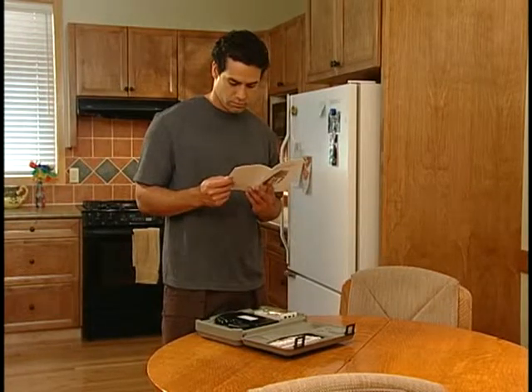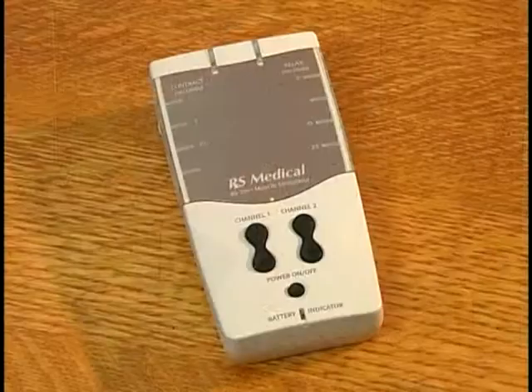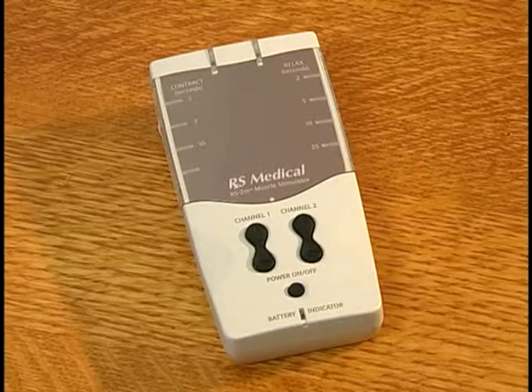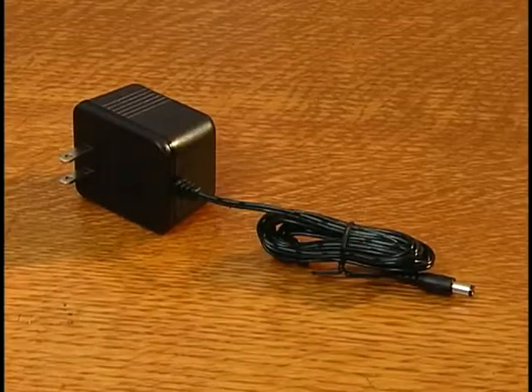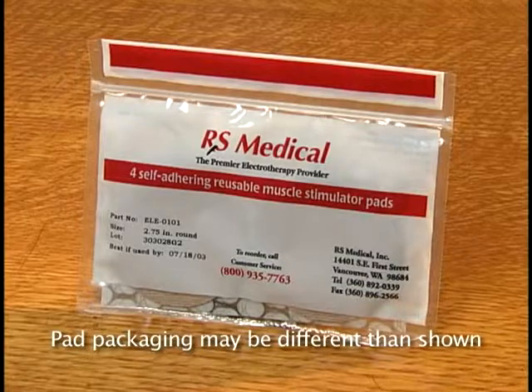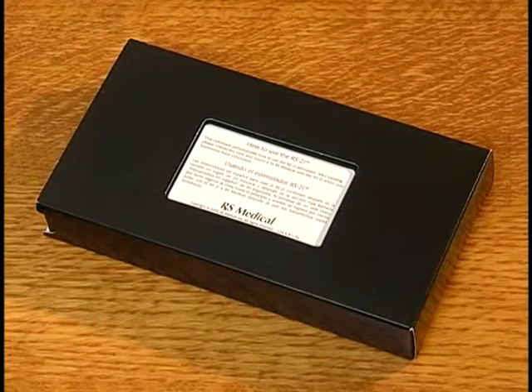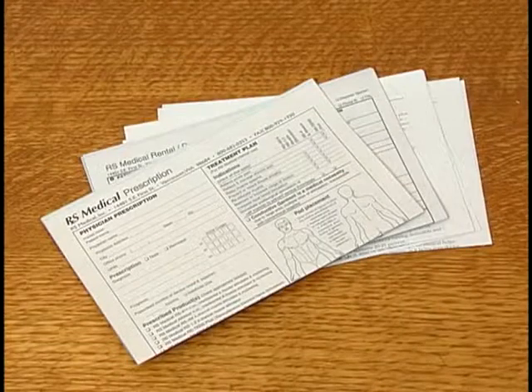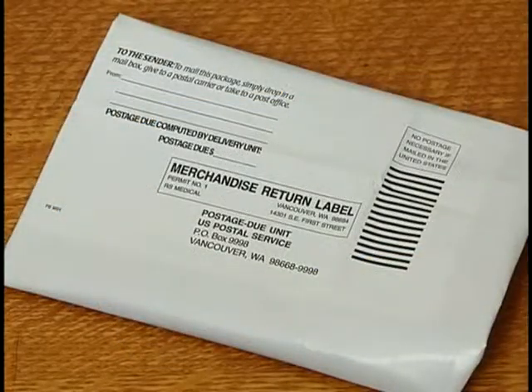The stimulator comes in a handy carrying case that includes everything you need: the RS2M stimulator, a set of cables, a battery charger, a package of reusable self-adhesive pads, an instruction manual full of helpful tips, the instructional videotape you are watching, patient information forms, and a white plastic return mailbag.